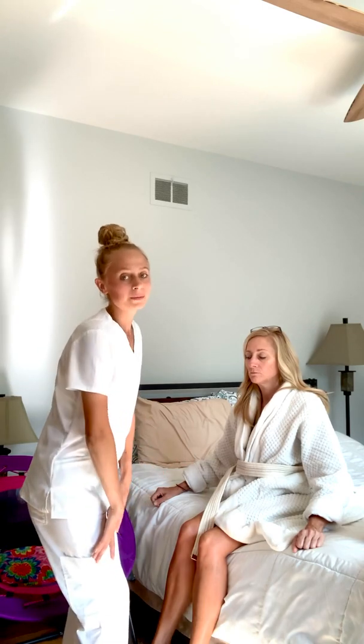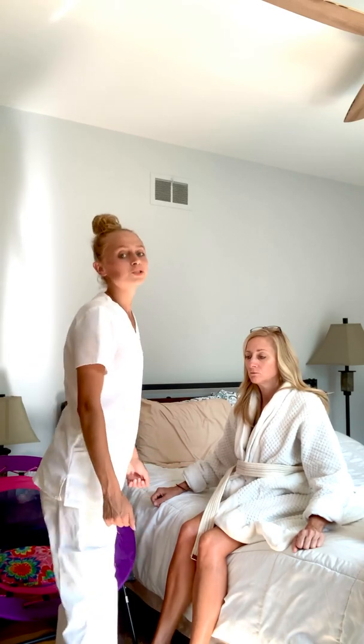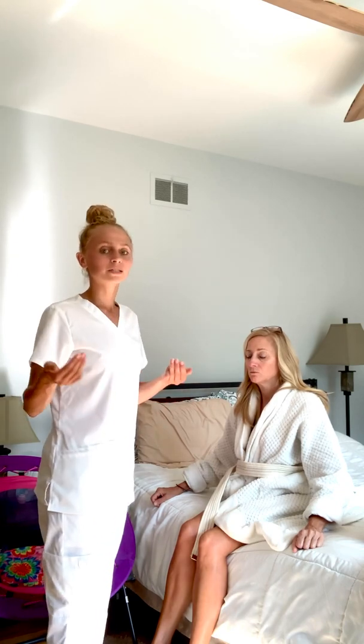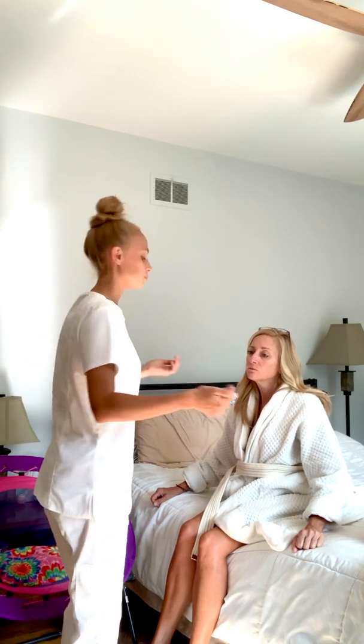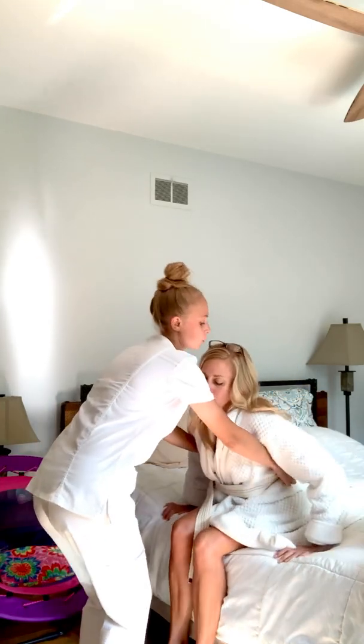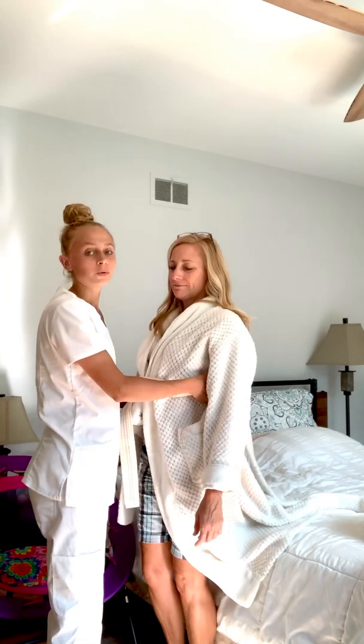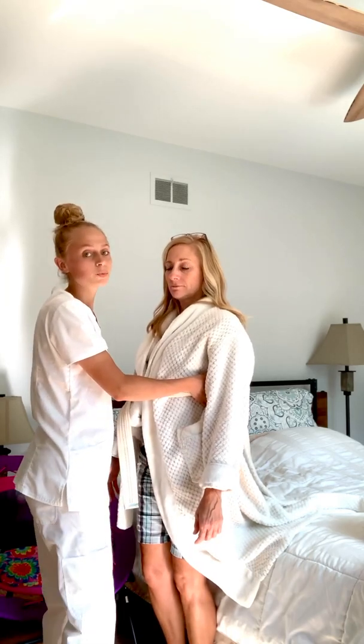And I am also bending my knees, and on the count of 3, I am straightening them and helping my patient stand up with my 2 fingers underneath her transfer belt. 1, 2, 3. And now we are going to slowly pivot towards the wheelchair.